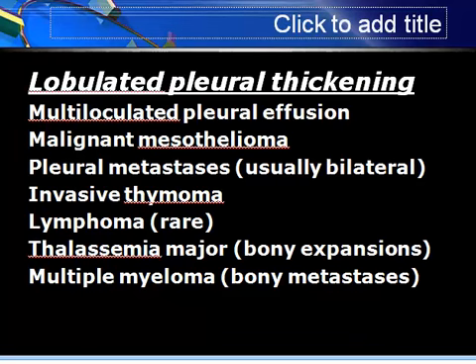Lobulated pleural thickening could be due to empyema infection, but more is due to malignant mesothelioma or pleural metastasis. Of course, direct invasion or secondary hematogenous could be. Both can do. Don't forget that multiple myeloma involving the ribs can extend into the pleura as bulging, and that thalassemia may cause bone expansion and extramedullary hematopoiesis.